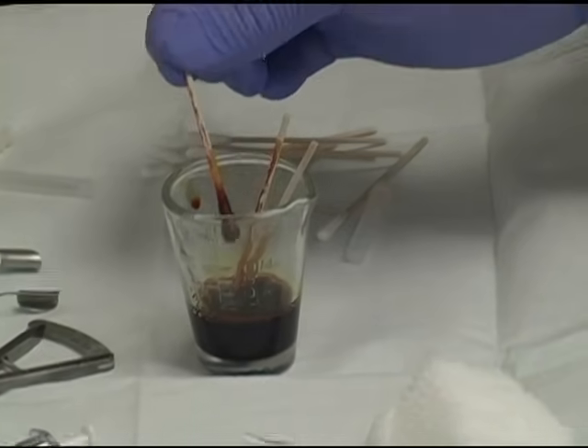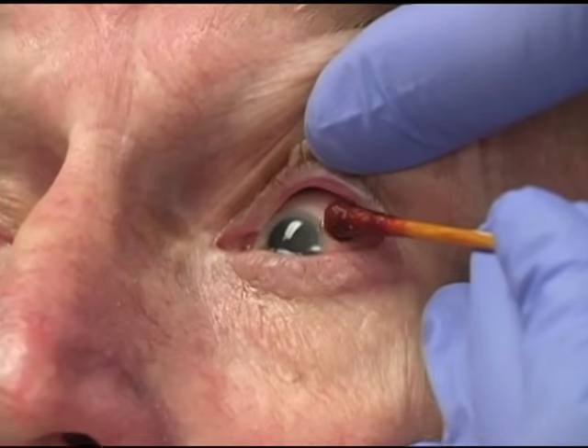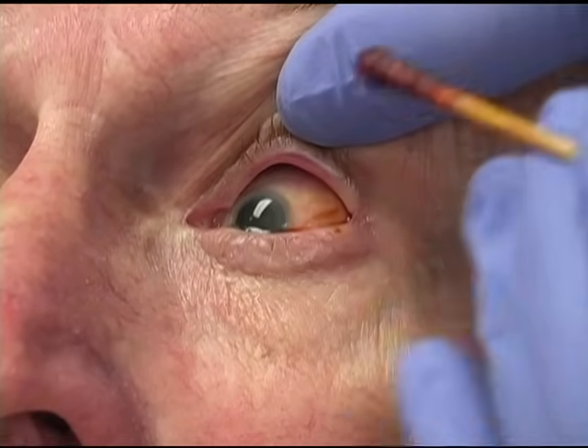While the anesthesia is taking effect, we paint the area of the conjunctiva where we are going to inject with 5% povidone iodine.